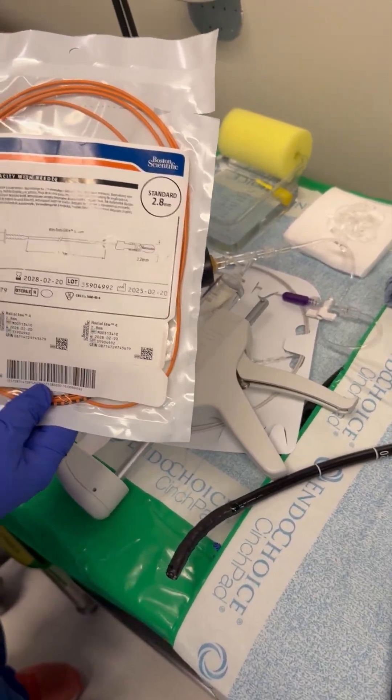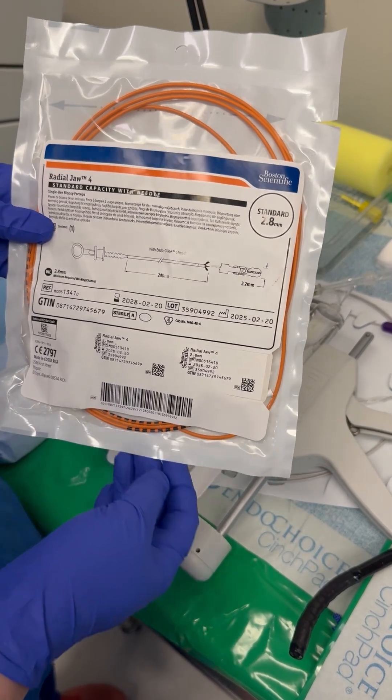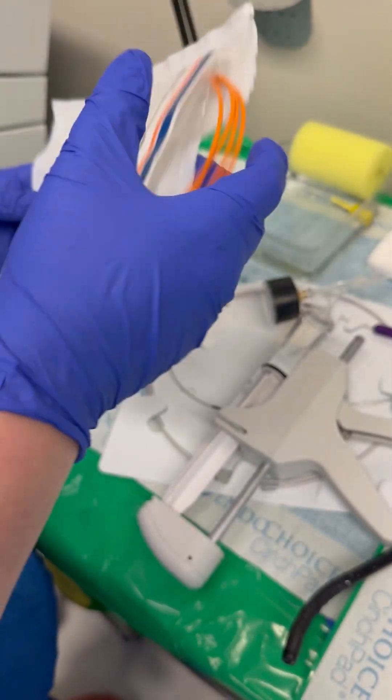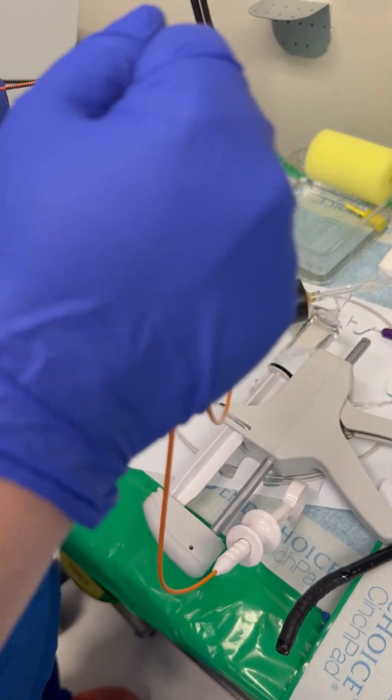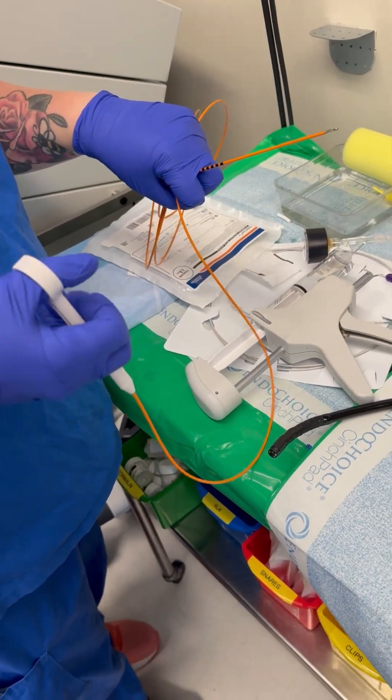Here we are going to demonstrate how to use the biopsy forceps. This is our standard equipment made by Boston Scientific. Our A-grade technician here will demonstrate.